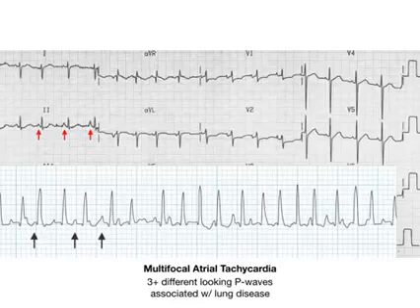And when you see that on the ECG, you'll see different looking P waves. One is sinoatrial, one's coming from the atrium closest to the pulmonary system, and you have all of this mismatch in electrical activity, which causes you to see different P waves on the electrocardiogram. So if you see 3 or more different P waves, it's multifocal atrial tachycardia.